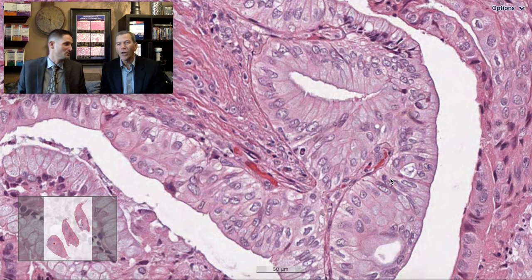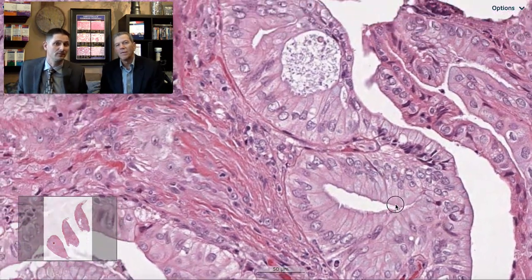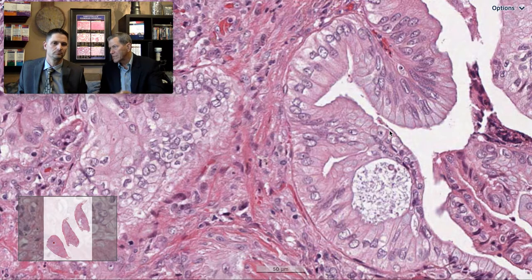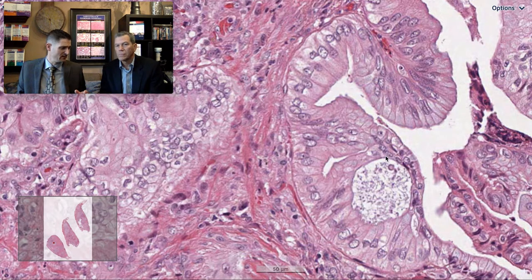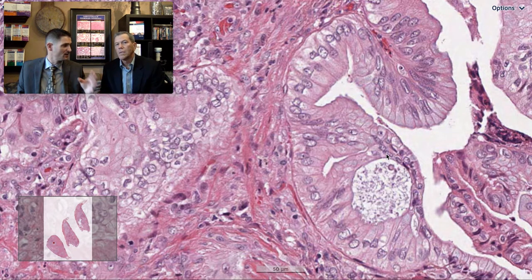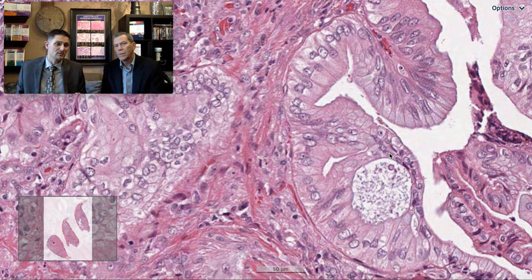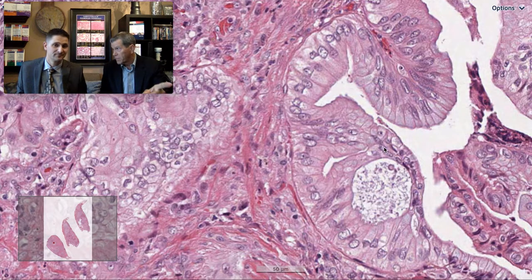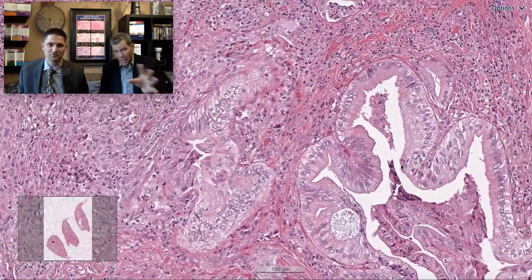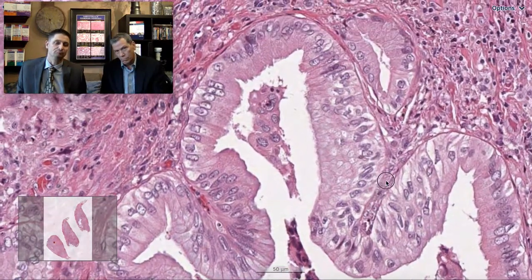Not a mucin stain — that won't help in the differential diagnosis. If this is tumor, there shouldn't be any normal basal cells. Is there a stain for basal cells in the lung? Yes — p63 or p40. Every bit of peribronchiolar metaplasia you've ever seen has a sprinkling of basal cells you can highlight with p63 and p40. Mucinous adenocarcinoma does not have any basal cells, so you'll see a complete absence — with a nice internal control where peribronchiolar metaplasia with basal cells remains positive.